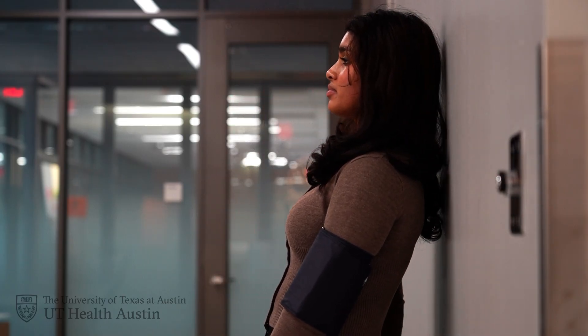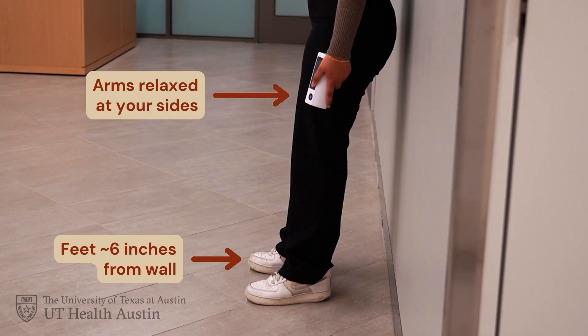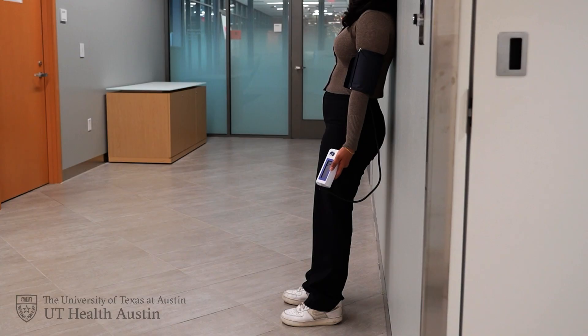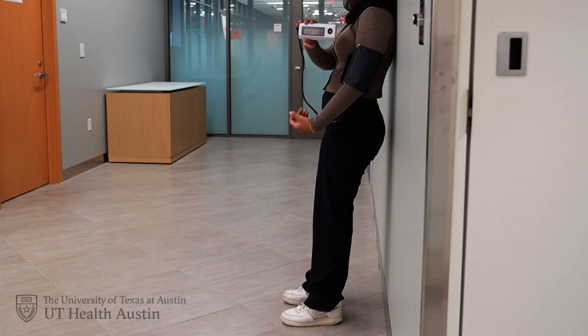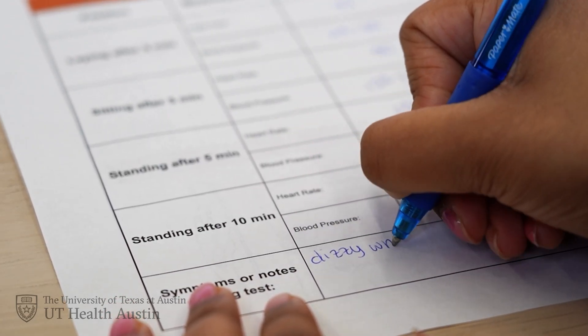For your third and fourth measurements, you should be standing up against the wall using the NASA Lean method. To do this, stand up against the wall and get yourself into the NASA Lean position. Rest your upper back and head lightly against the wall, keep your feet about six inches from the wall, and relax your arms at your sides. Avoid leaning your buttocks against the wall to ensure a proper position. After five minutes in this position, take and record your heart rate and blood pressure. Stay in the same position for another five minutes, which is a total of 10 minutes standing. At the end of 10 minutes, take and record your heart rate and blood pressure again. During this test, write down any symptoms you experience like dizziness, lightheadedness, or heart racing.